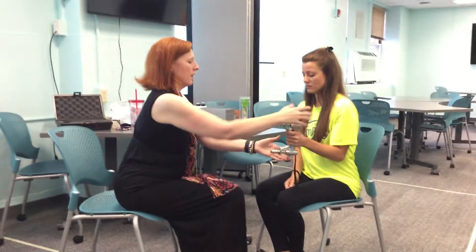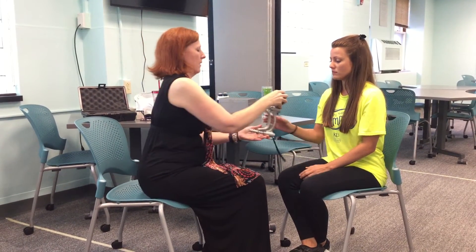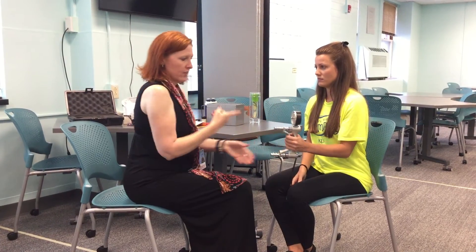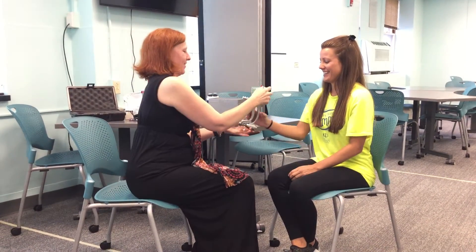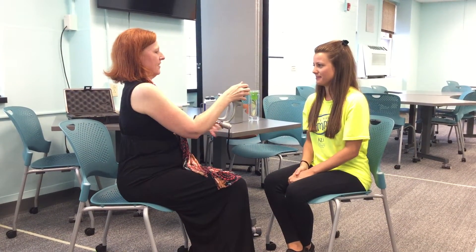Now we're going to do the left hand — squeeze as hard as you can. That's 65 pounds. Normally I write these down — right, left — and I record because we're going to do a trial of three, alternating each time. 66... 62. One more each hand. 64.